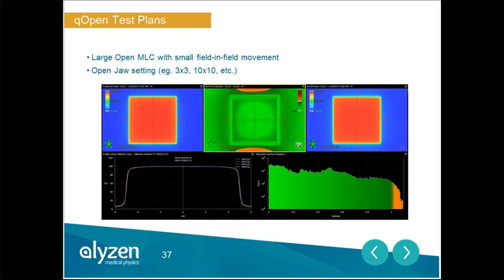But the first thing I want to check on this is I always jump straight to the 10x10. And I want to see that my calibration and my prediction give me the same dose. If they don't, you can easily go into those output factors and scale that output factor from 1 to, say, a 0.998, for example.